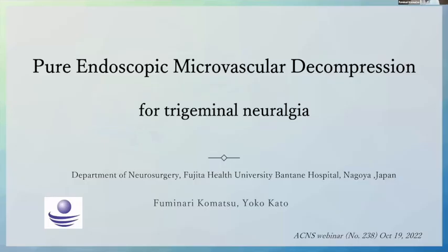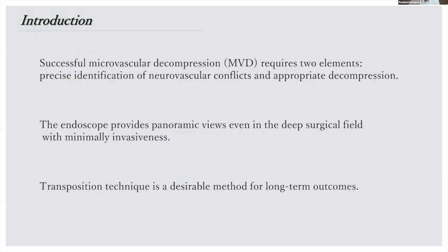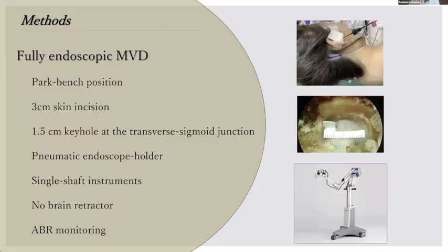So today my topic is pure endoscopic microvascular decompression for trigeminal neuralgia. So successful microvascular decompression requires two elements: precise identification of a neurovascular conflict and appropriate decompression. The endoscope provides panoramic views even in the deep surgical field with minimal invasiveness. Transposition technique is a desirable method for long-term outcome. So I will introduce our method of fully endoscopic microvascular decompression.